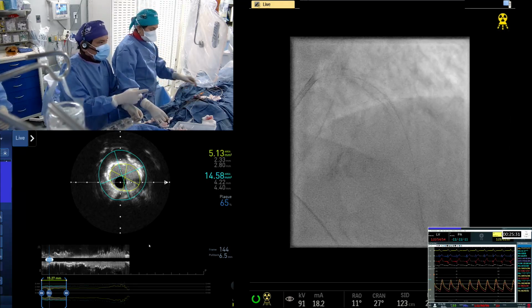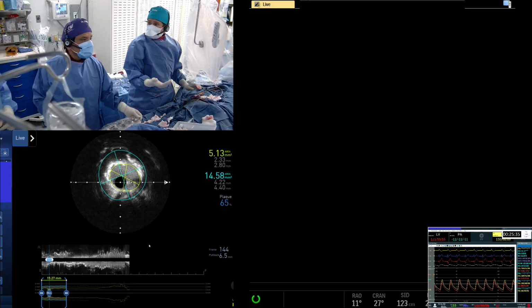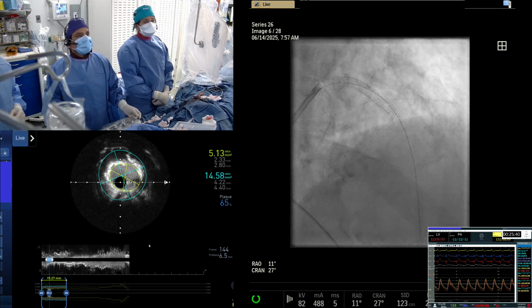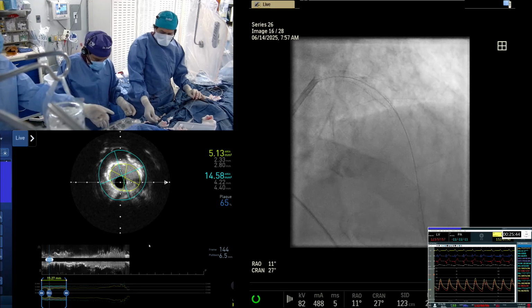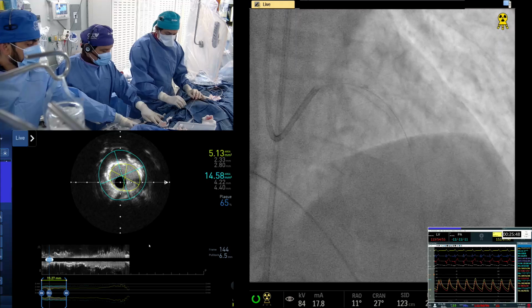Pacemaker, we can remove the pacemaker, it's dependent. You will not be able to see the boost. I don't know why you need the boost. It's too much radiation. Enhancement failed. It's still more radiation. Okay, hold it. We needed a balloon also.